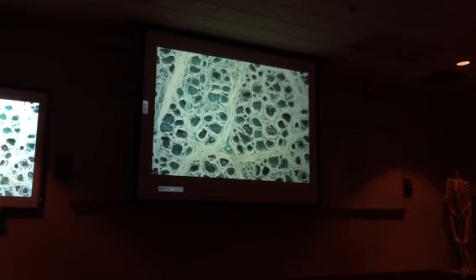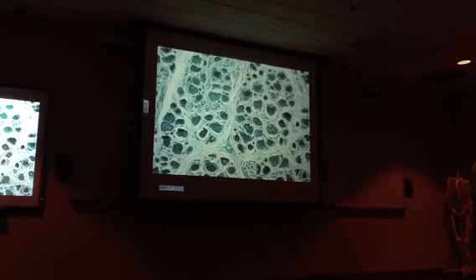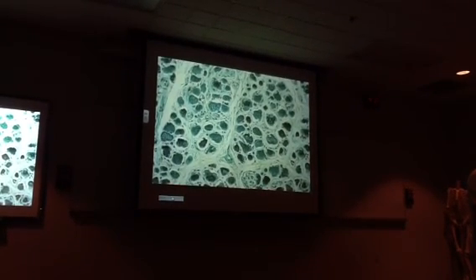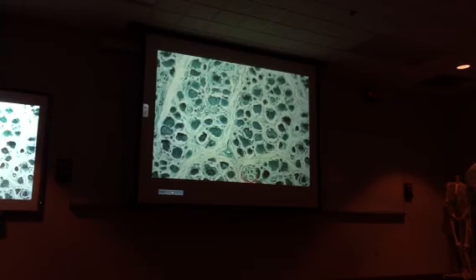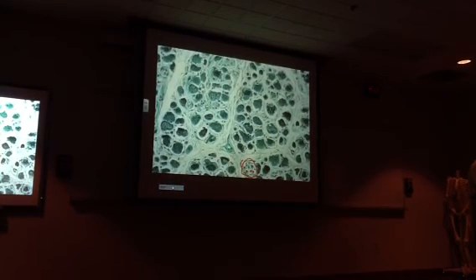This one is a really horrible slide. Okay, it's skeletal muscle. Dr. Scalco has an interesting story on this one. And I don't know if the story is true. Okay, right here is a muscle spindle with the little intrafusal fibers.